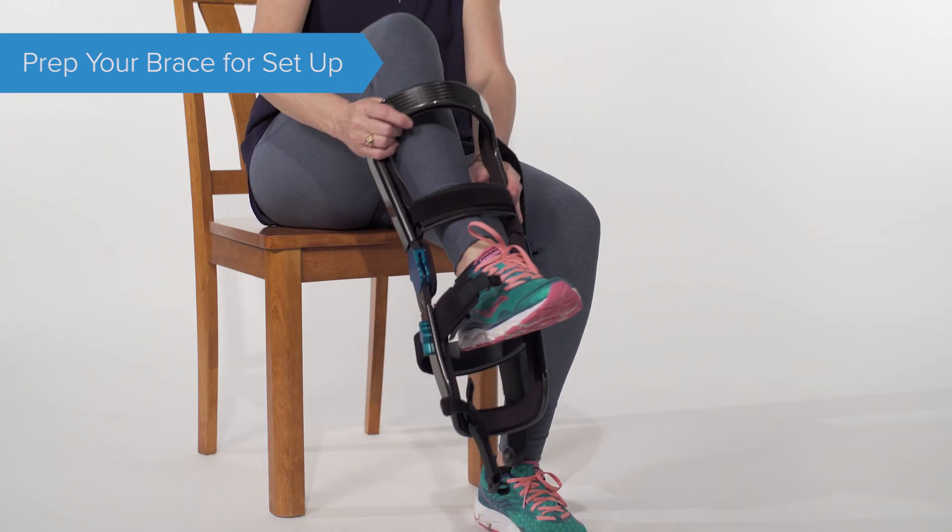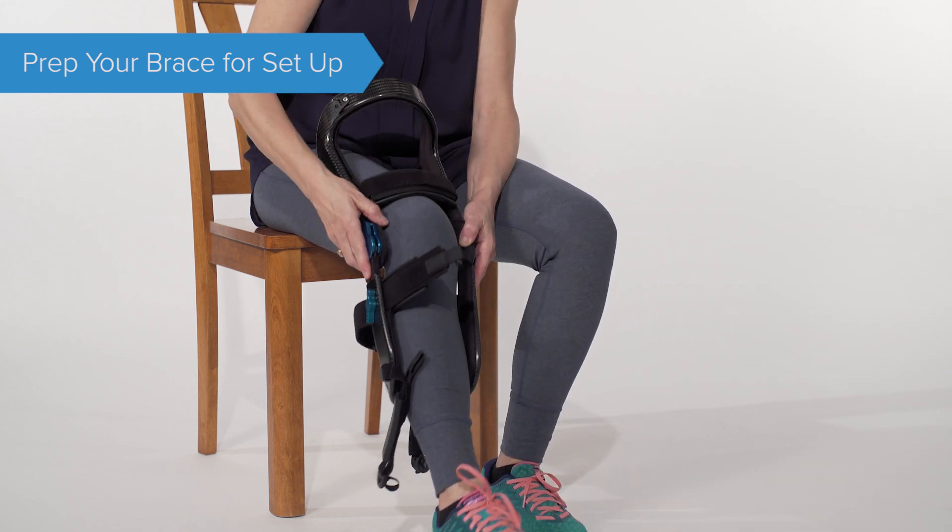Put your foot through the middle of the brace and align the brace center of the hinge with your knee center.